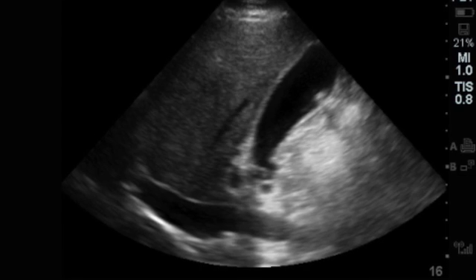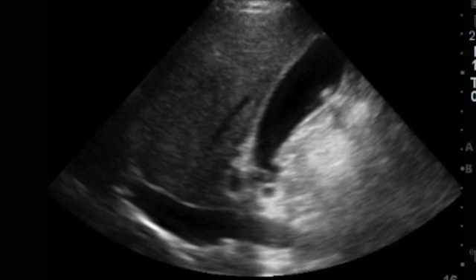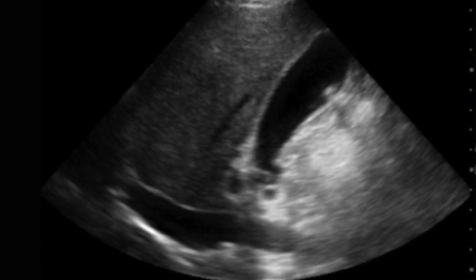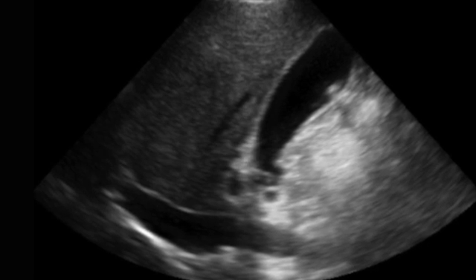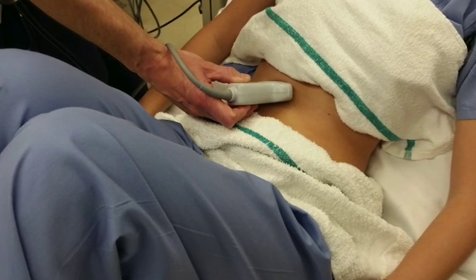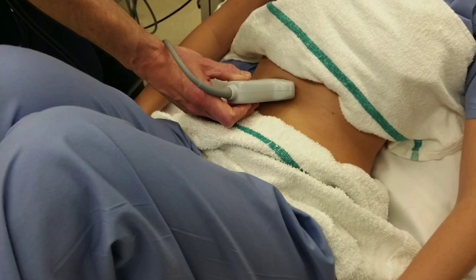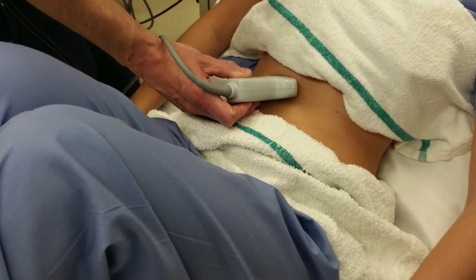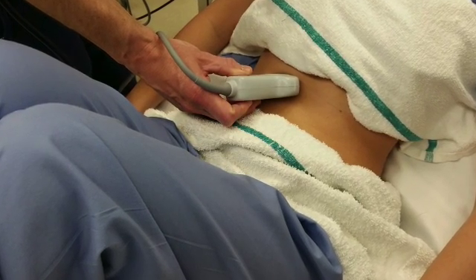Likewise, you can push down hard directly over the gallbladder to see if this is tender to the patient. A couple of tricks: if you're having a difficult time seeing the gallbladder, you can have the patient lie on their left side or have them sit up. Sometimes this brings the gallbladder into view.